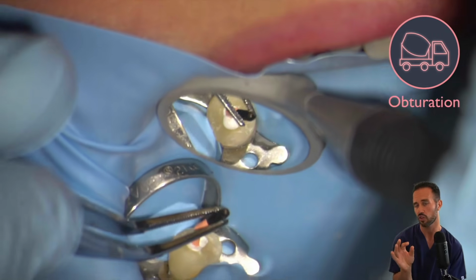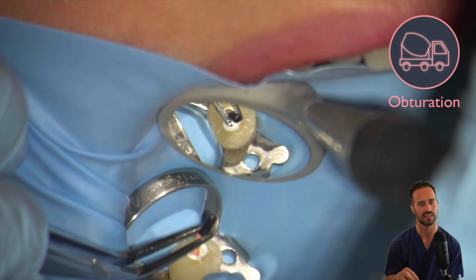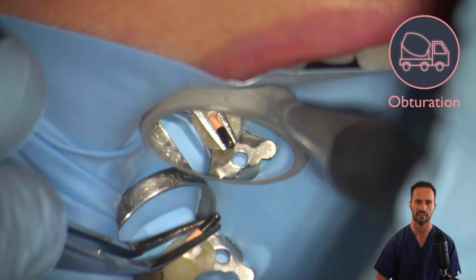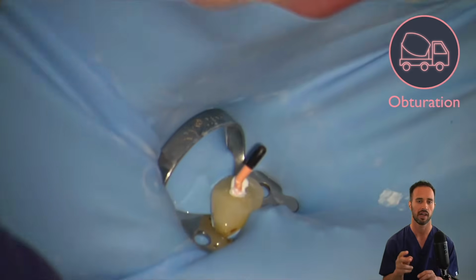You want to make sure that you crimp the gutta percha cone so that you have a really obvious reference point to go by to make sure that it's seated all the way to length. And once we have that seated all the way to length, we're going to take our cone fit radiograph, and you'll actually see that the gutta percha cone is slightly sticking out of the root here. So I felt that needed a little modification.